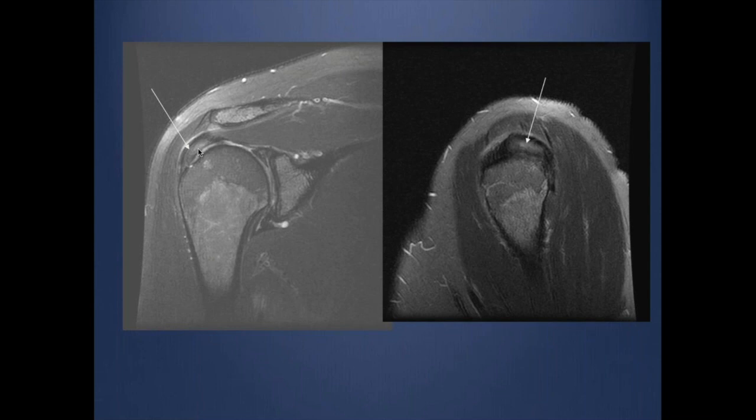This is because with low TE, we know we might have a magic angle artifact, particularly with a tendon that changes direction.